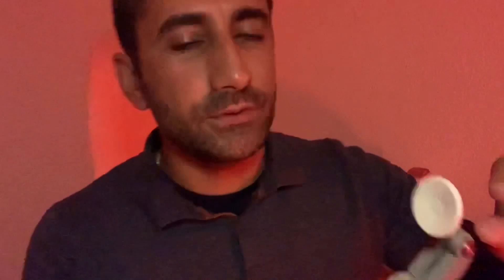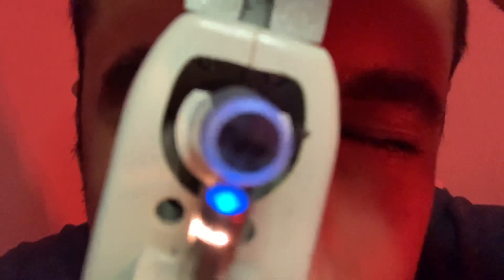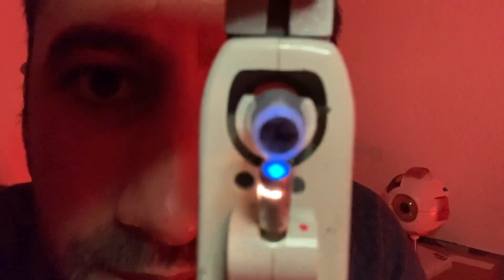We have the correct reading on the scale — the correct starting point — and again we'll use the headrest against the forehead. Looking straight — blink — and we'll bring it just delicately against the cornea. Looking at the scale there, we have a reading of 12 millimetres of mercury. Excellent. And then just the same for the left eye now — looking straight, blink, and we'll bring it just against the cornea. Good — 14 millimetres of mercury. Excellent.